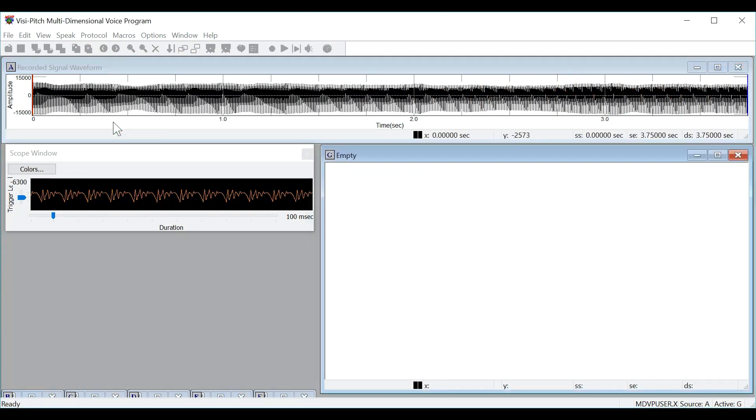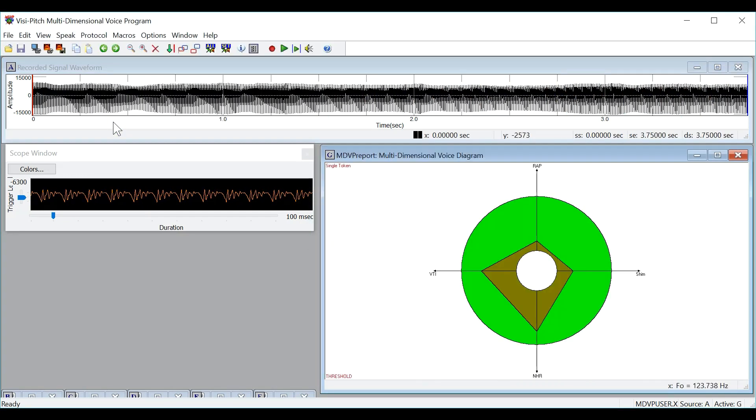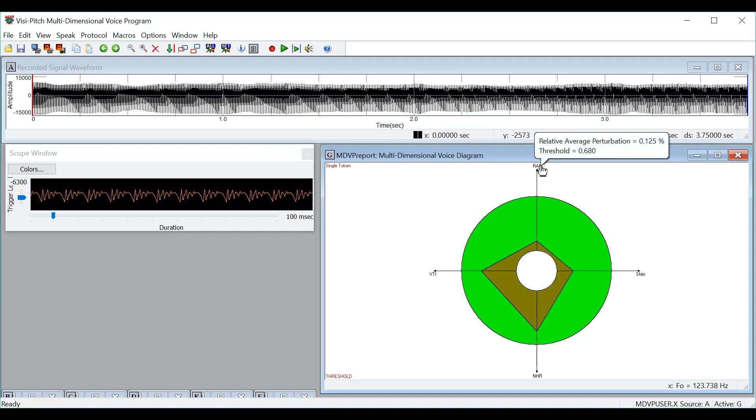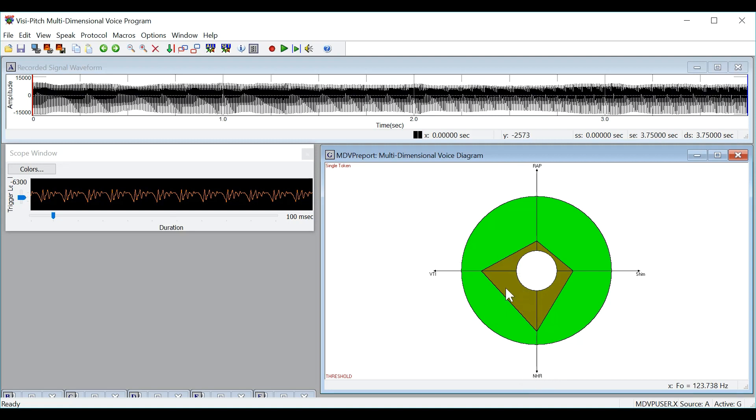You will see that the program plays the signal back and then performs the analysis. Here in window G, you will see the MDVP analysis. You will have the relative average perturbation, or jitter. You will have shimmer, noise to harmonic ratio, and voice turbulence index. You will see that normal values fall within this green circle.